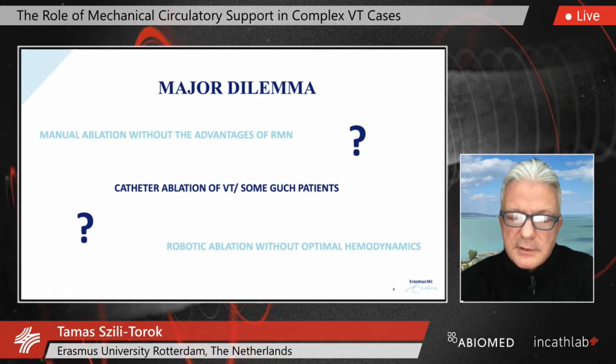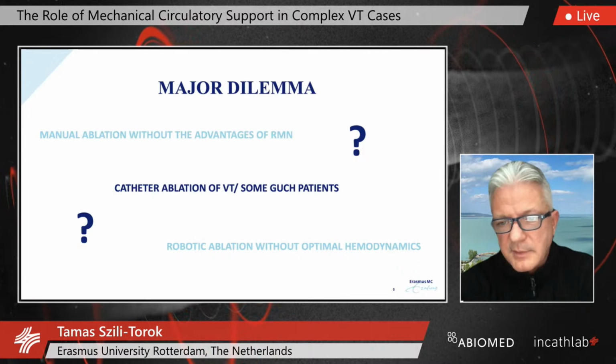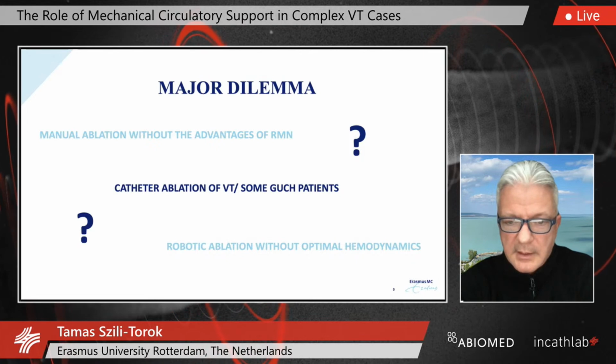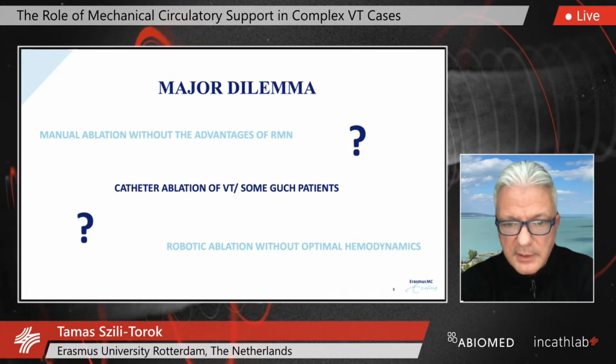But for other patients, when we need mechanical support, I was very curious whether we can implement the Impella, and this is one of the take-home messages today: we pre-tested it in the magnetic lab, and then we did quite a few patients in the last years, not enough, unfortunately, due to financial considerations, but I would use it much more if it were better reimbursed in our country. And I choose mechanical support with robotics when I have the Impella device.